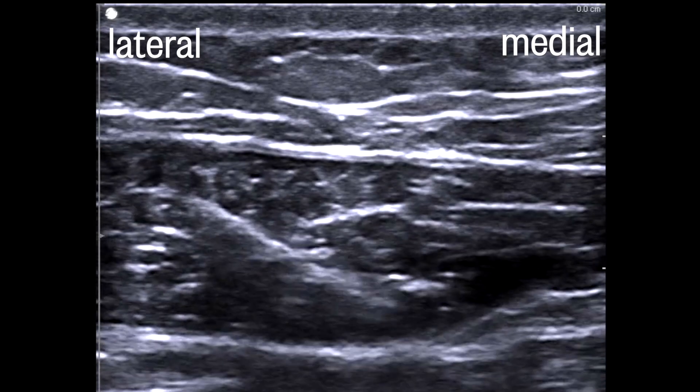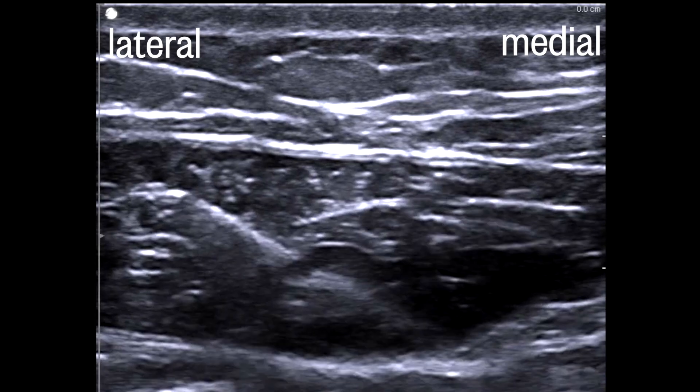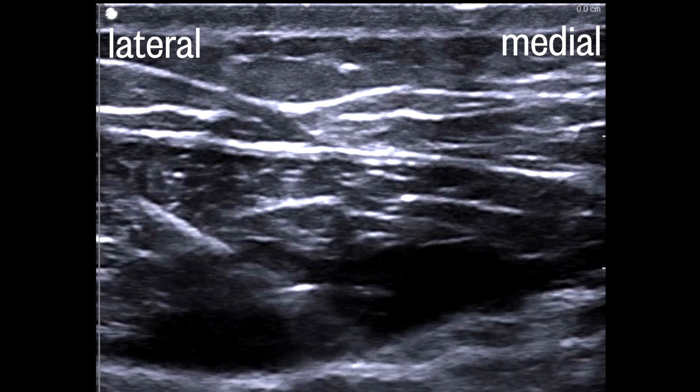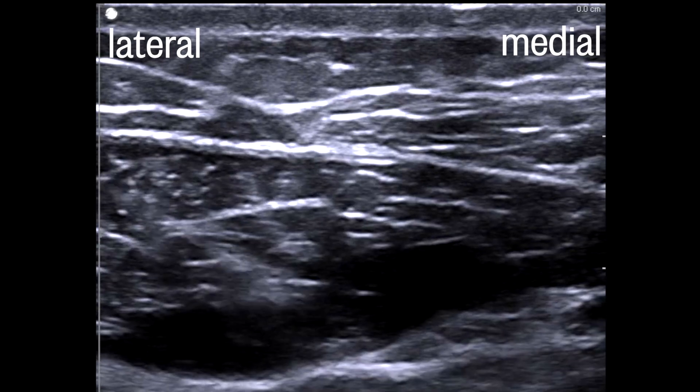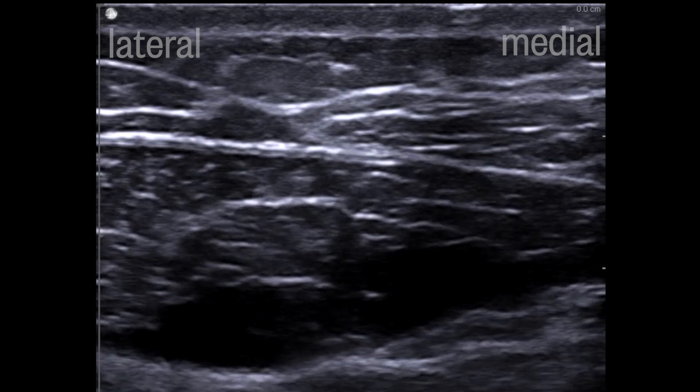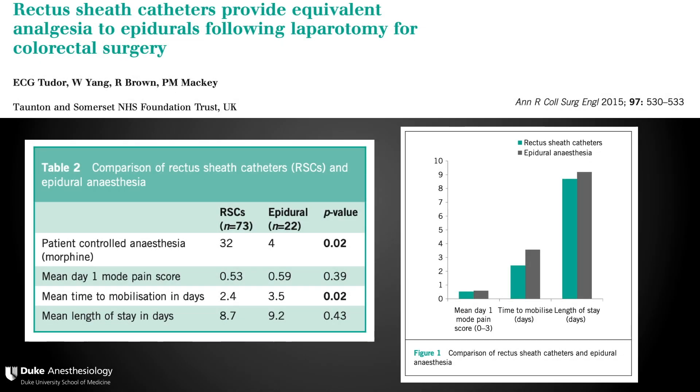You should see the muscle lifting off the bright fascia, with the local anesthetic spreading both medially and laterally. It's common for the first injection to be intramuscular — better to be safe and have to advance than to inadvertently advance too deep. Once you've injected your 20 mils, the needle is withdrawn and the procedure is repeated on the other side.